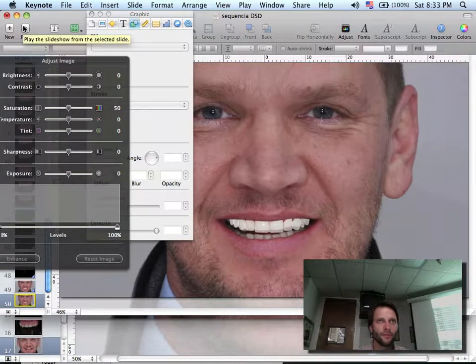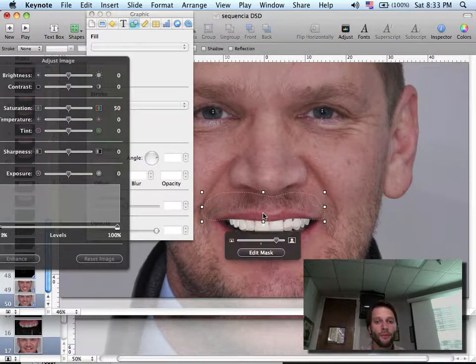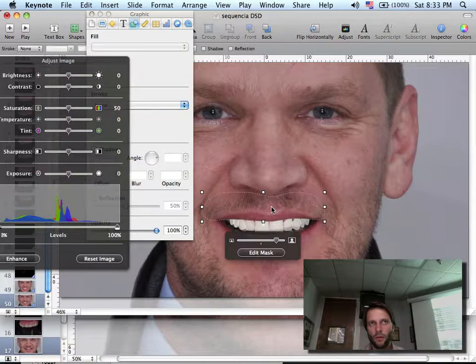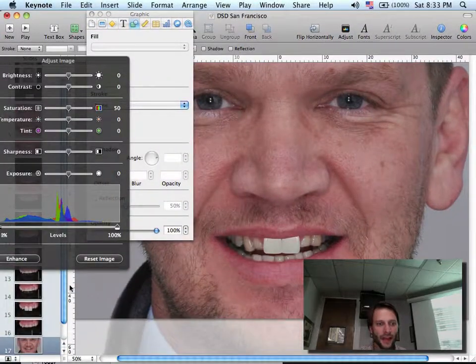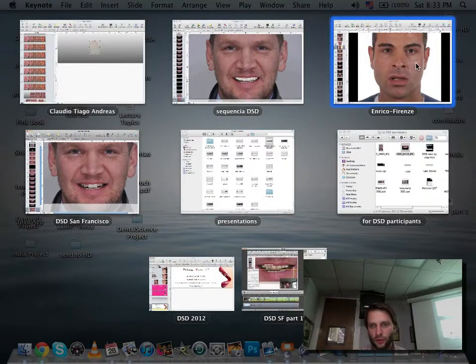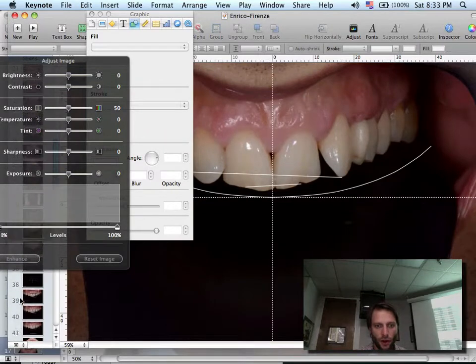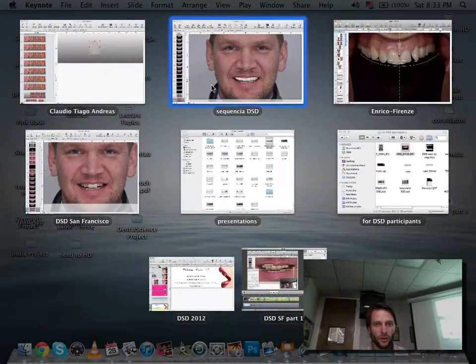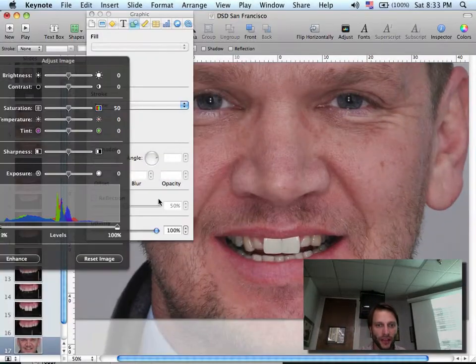From you cut that outline again and paste it onto another picture to capture that. Huh? Capture that part of the other photo to bring back the initial step where you took the outline of the tooth and transported it over to a sample. This actually is a tool on Keynote that you can make a drawing on top of the tooth. You can draw on top of a picture and crop the picture with any shape you want. Not using the one we just did? You can use the one you just did.